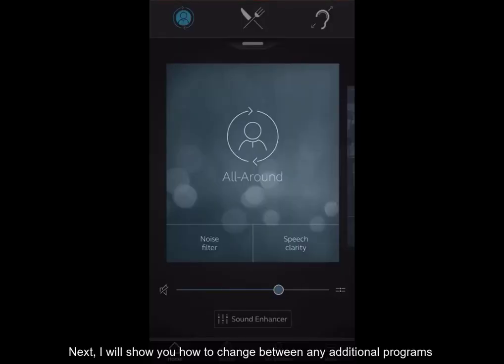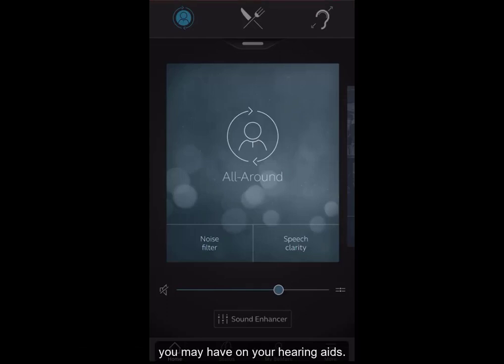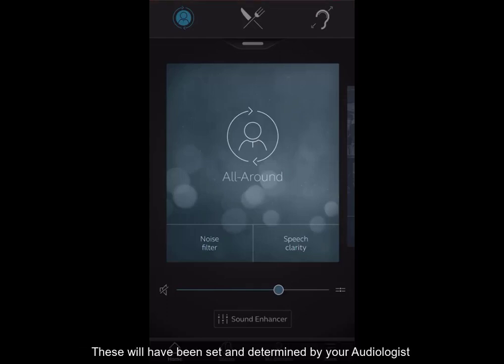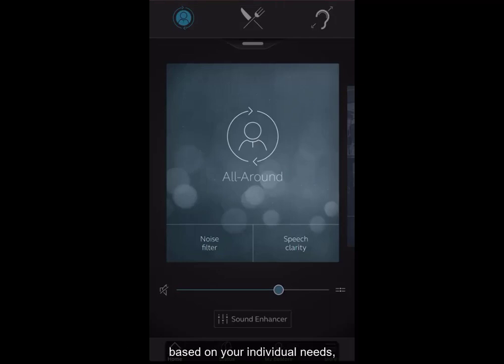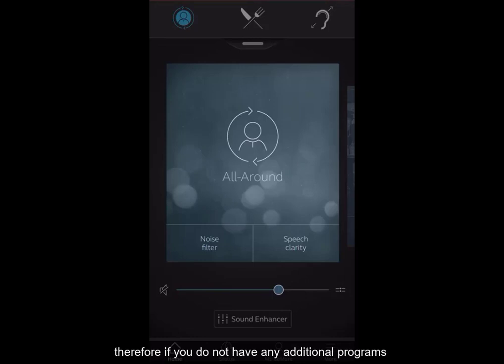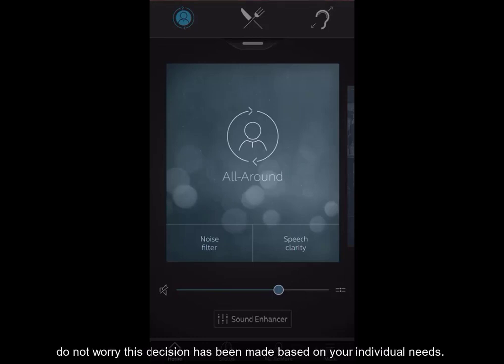I will show you how to change between any additional programmes you may have on your hearing aids. These will have been set and determined by your audiologist based on your individual needs. Therefore, if you do not have any additional programmes, do not worry as this decision has been made based on your individual needs.